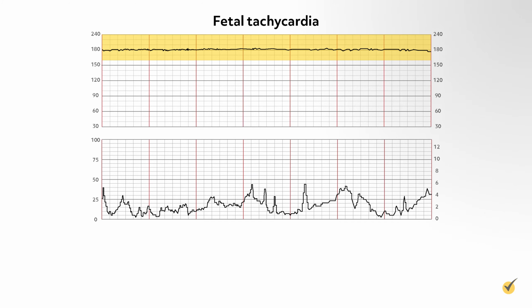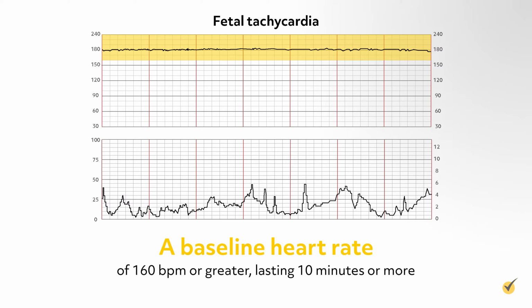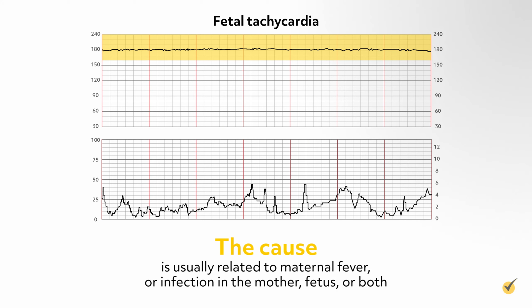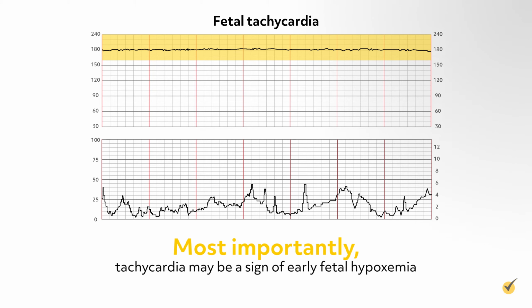Fetal tachycardia is defined as a baseline heart rate of 160 beats per minute or greater, lasting 10 minutes or more. The cause is usually related to maternal fever or infection in the mother, fetus, or both. Most importantly, tachycardia may be a sign of early fetal hypoxemia.